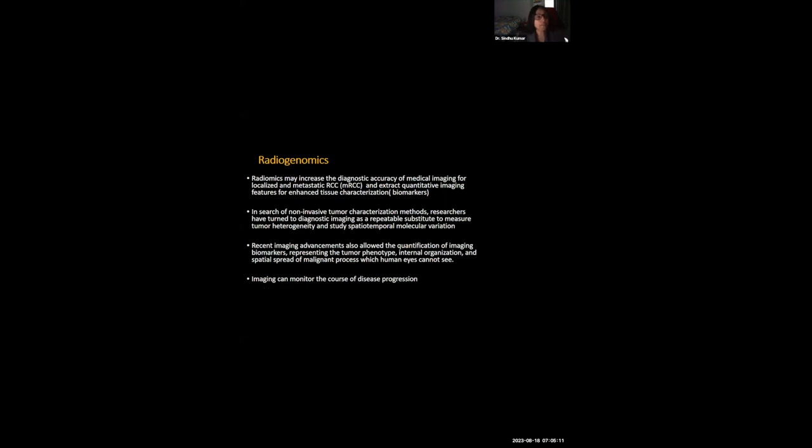So, talking a little bit about radiogenomics. Radiogenomics focuses on two components, including radiomics. Radiomics focuses on improving the analysis of large data sets using semi-automatic and automatic software for quantitative image analysis of texture and features provided by imaging tools, that is MRI, multiparametric MRI, with specific software which incorporates all these features. And radiogenomics is the linkage between imaging and genomic data.